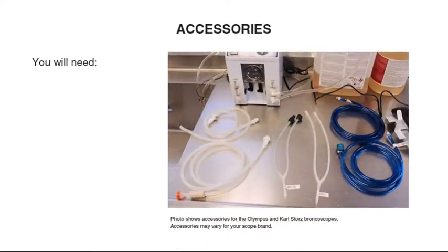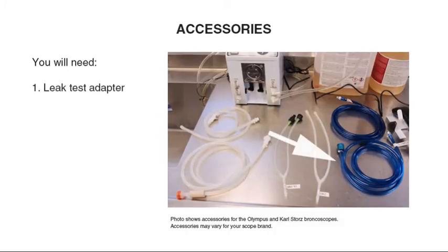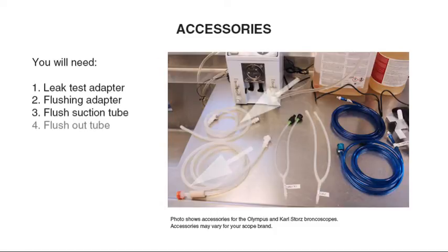To use the Scopetech DF for your flexible endoscope cleaning, you will need a leak test adapter, flushing adapter, flush suction tube, flush out tube, and enzymatic sponge and brush. This photo shows accessories for the Olympus and Karl Storz bronchoscopes. Accessories may vary for your scope brand.